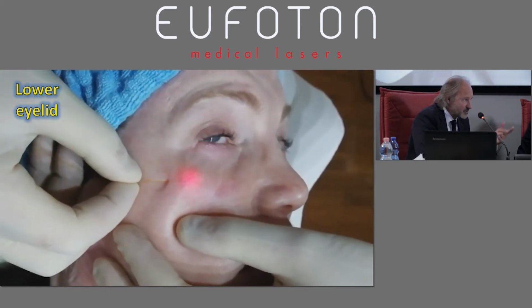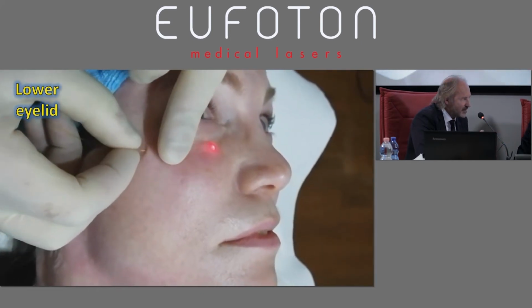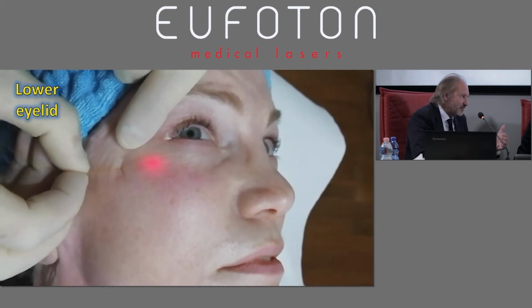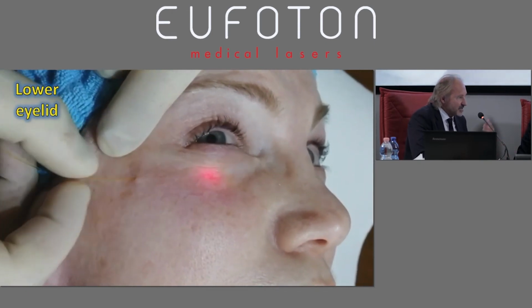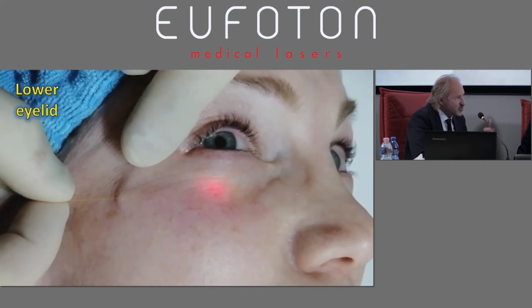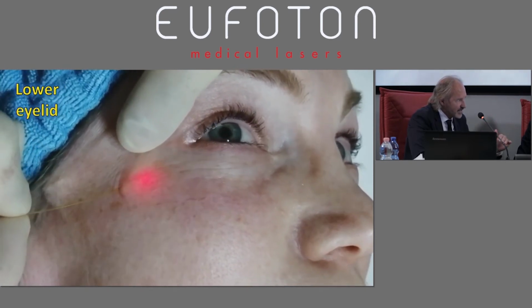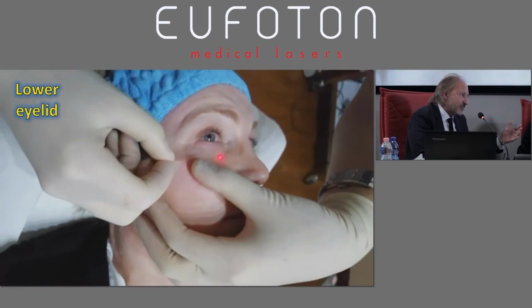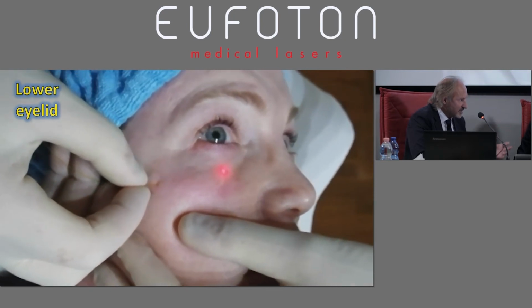And at the same time, after 2, 3, 4 months, there is a recurrence of the tumescence because you didn't take the filler out fully. So Endolift. Hyaluronidase doesn't go beyond a certain level. And then, with this atrophy, the situation worsens. So Endolift can remove the filler. Hyaluronidase first step, Endolift, and then regenerating products, injectables.